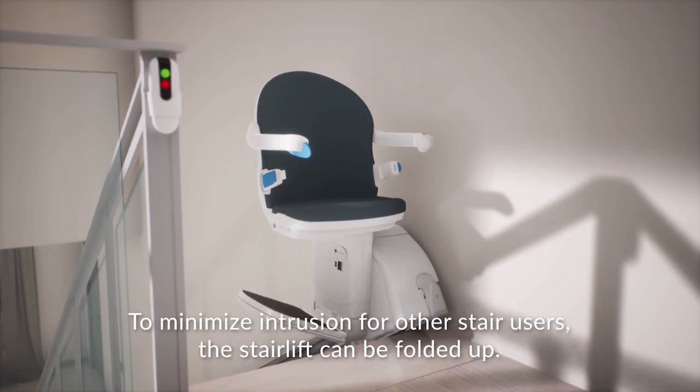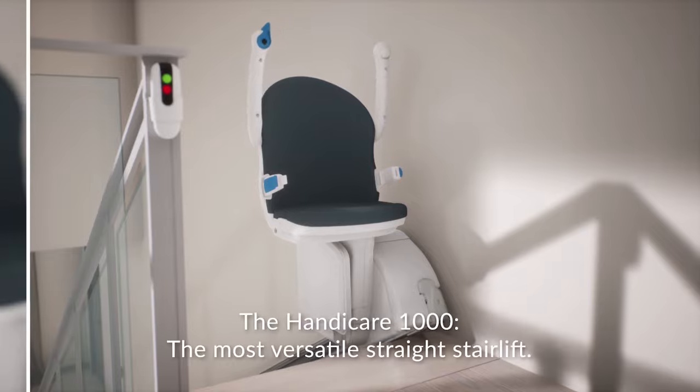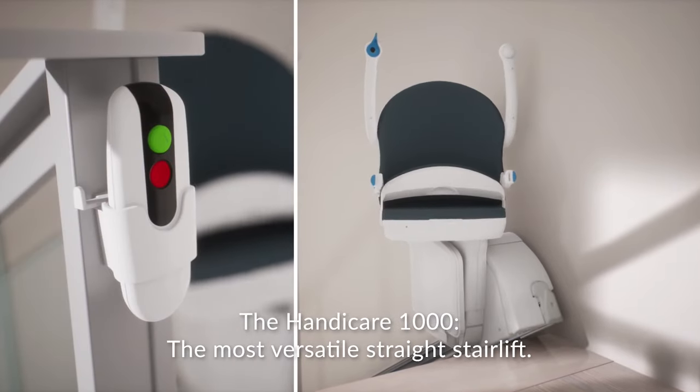To minimise intrusion for other stair users, the stair lift can be folded up. The HandyCare 1000. The most versatile straight stair lift.